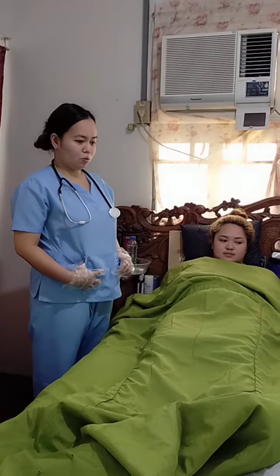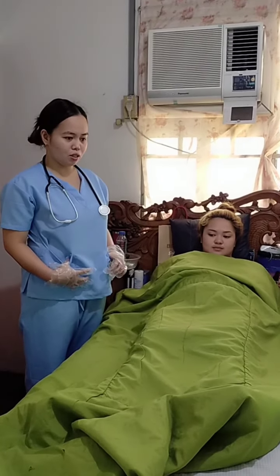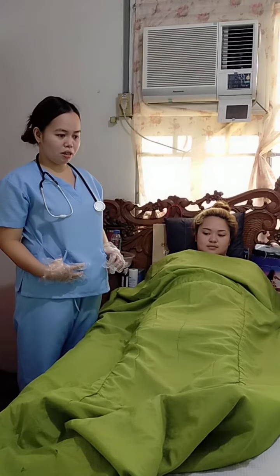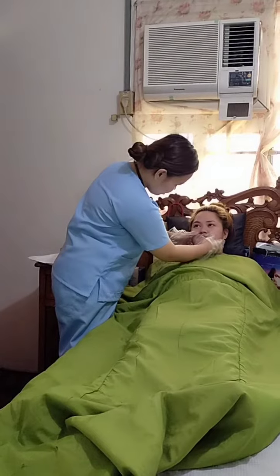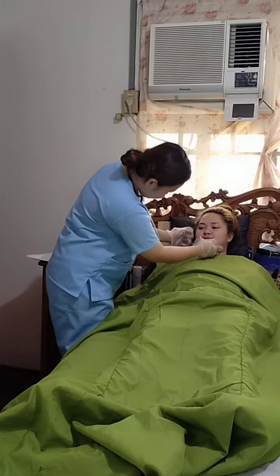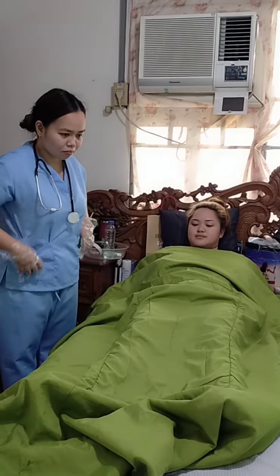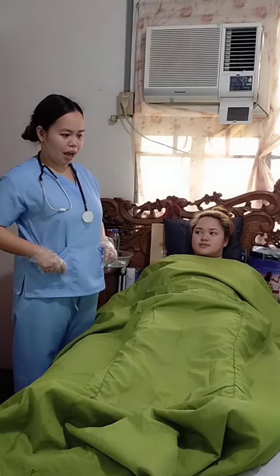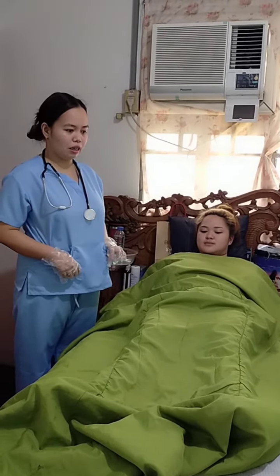Now I'm going to check the nostrils. The tube passes more easily through the nostril with the largest opening, so we have to check which is the better one. To check for patency, ask the client to occlude one nostril and breathe normally through the other.